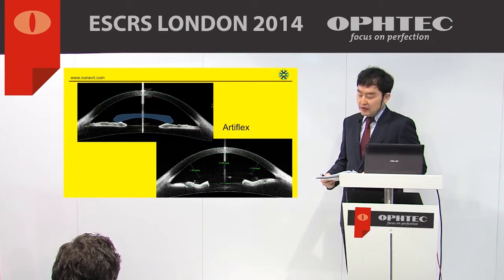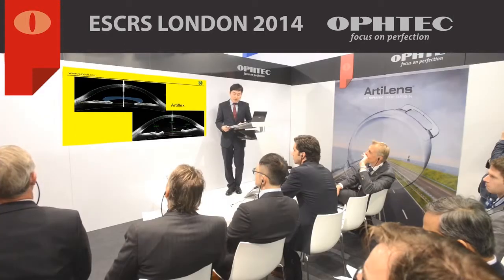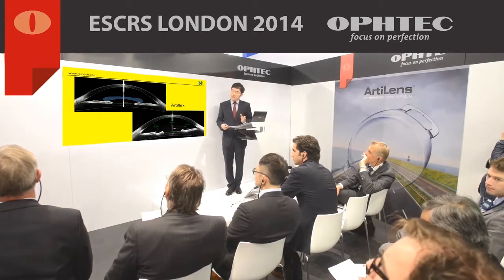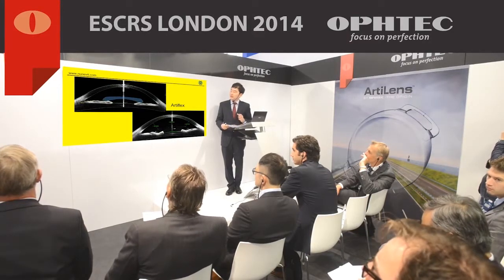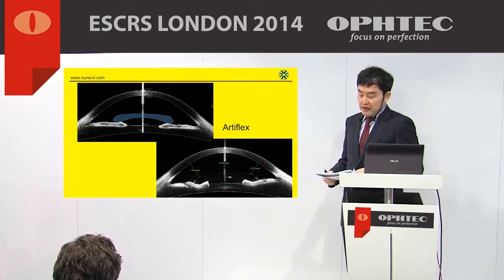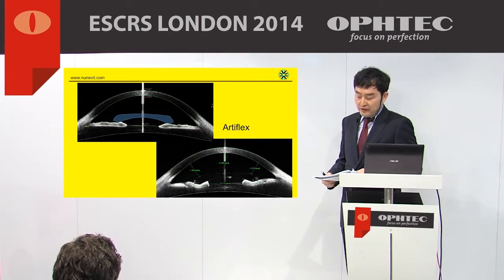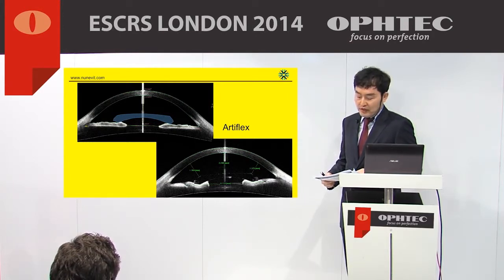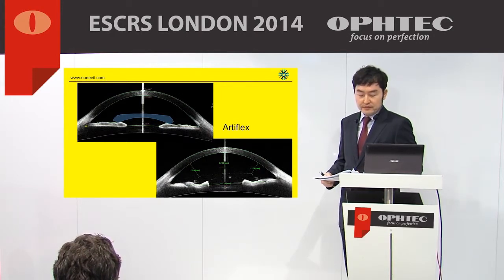If you draw the Arti-Lens on this image, you will be able to know the clearance. If you compare the image from Cassia with the post-op result, you can see the clearance shown is pretty similar. Therefore, if an anterior OCT like Cassia is equipped in the clinic, I think it would be the easiest and most accurate method for anterior chamber assessment.